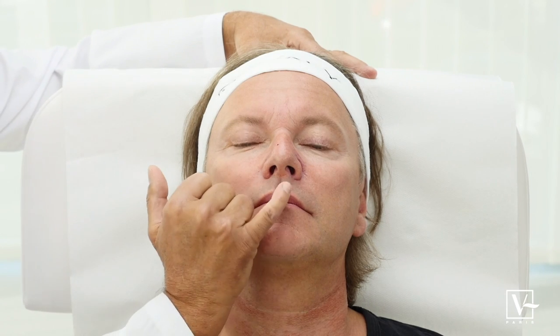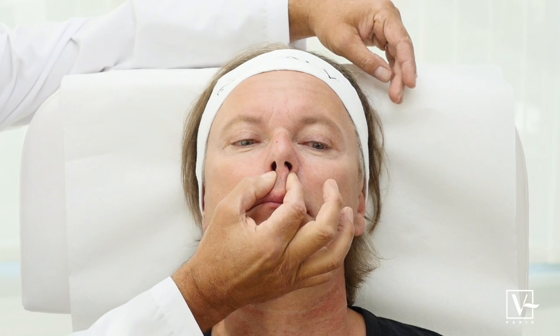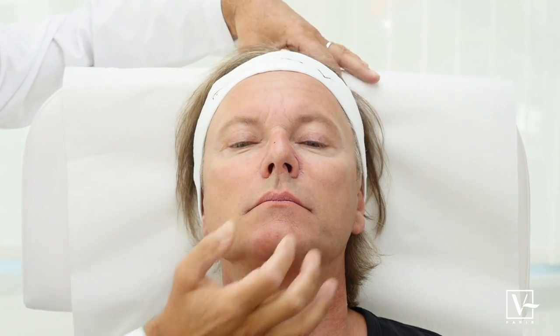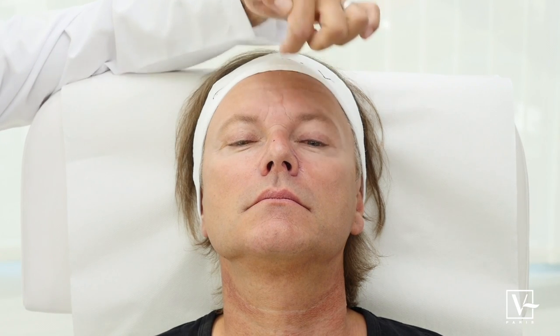For that we're going to use Stylage XL with lidocaine, and that could be enough if the tip is lifted sufficiently. We can also use a drop of Stylage XL on the nasofrontal angle.